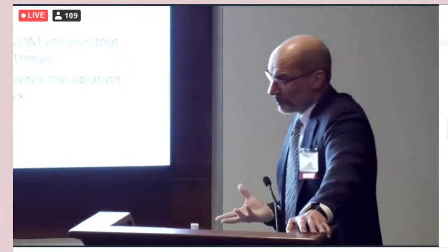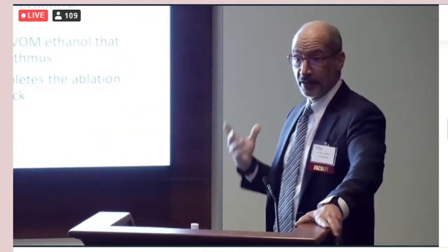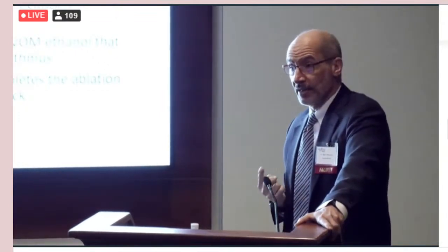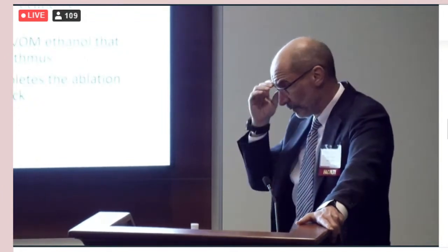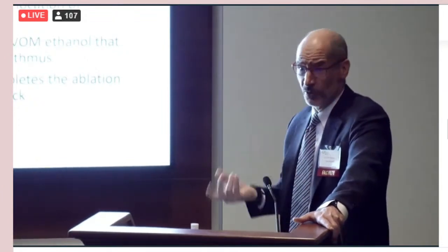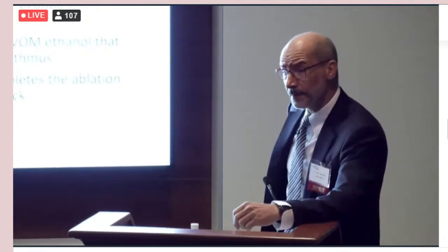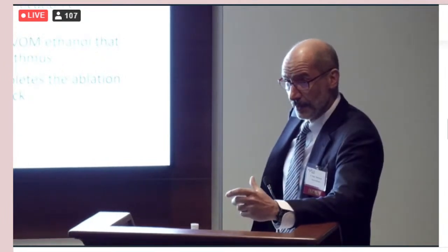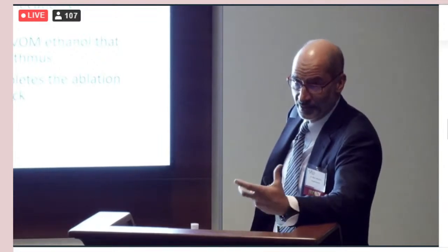The Bordeaux group, I think they give 10 cc's on everybody, and they give 3 and 3 or something like that. They have had one case of what they thought was alcohol-induced anaphylaxis. I think it was just a bolus of alcohol. That is a potent vasodilator. So 1 cc at a time. The syringe has to be a small syringe because it's hard to push.